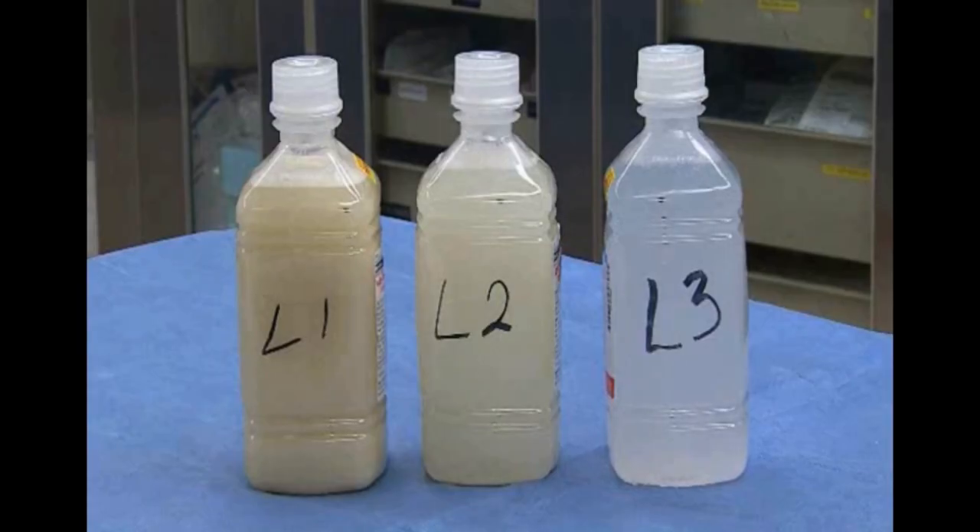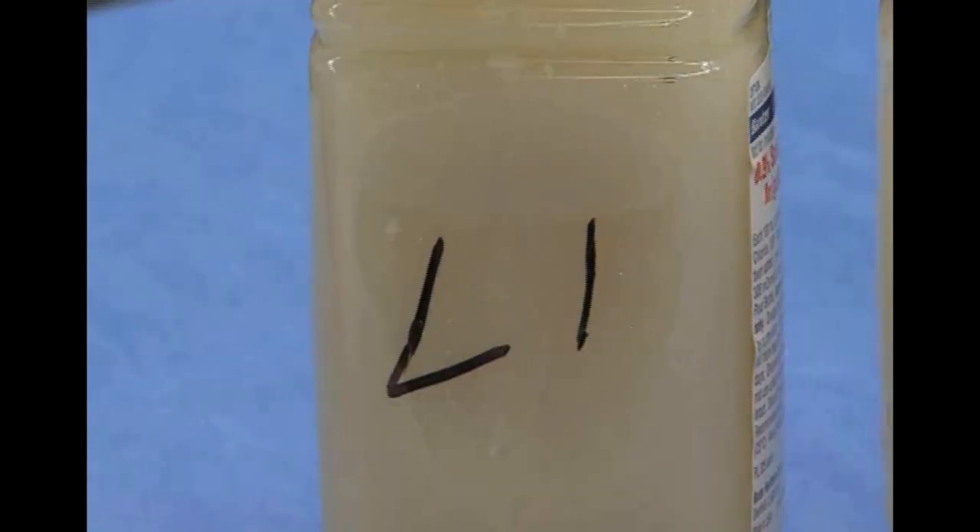As you see, this is L1 — the left one — the first wash, then the middle of the procedure, and toward the end of the procedure. In this particular case, we used about 30 liters for each lung.